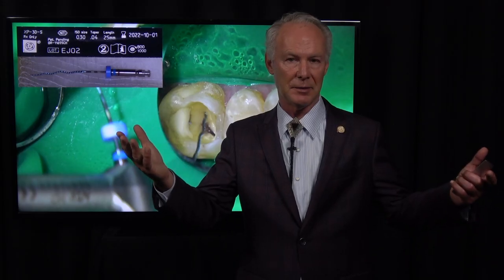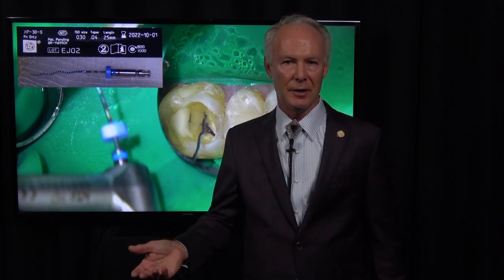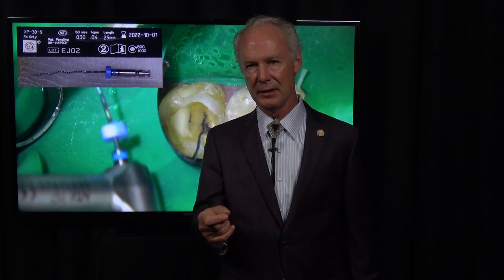It's kind of like the old silver points, and I've got lots of patients in my practice that had silver point root canals 40 years ago, and most of them are still holding up fine. So if you were to separate a file and you had cleaned the canal thoroughly and irrigated it prior to using the drill, I'm not going to try to retrieve that file. I don't ever remember a patient having a problem if it was cleaned and irrigated thoroughly with the hand files prior to the drill.